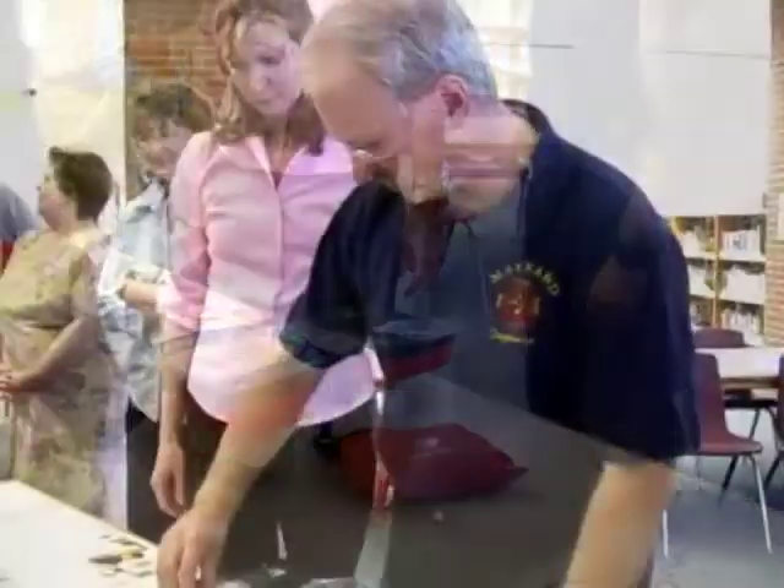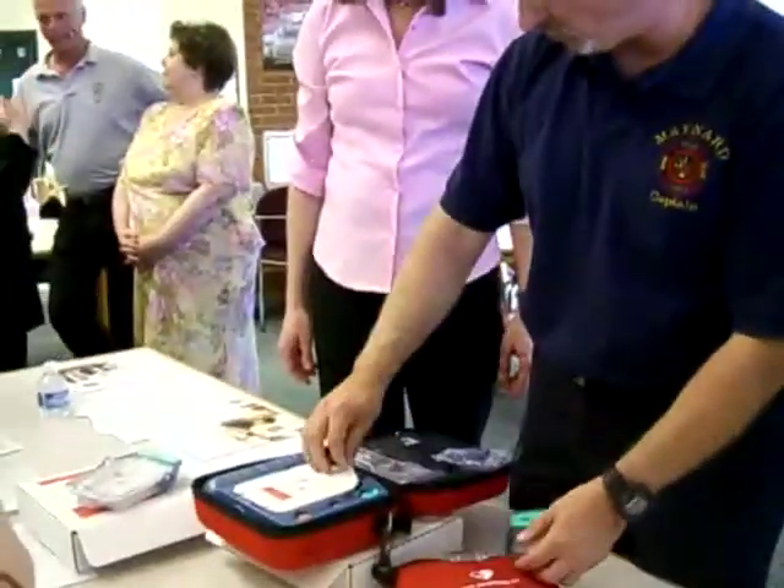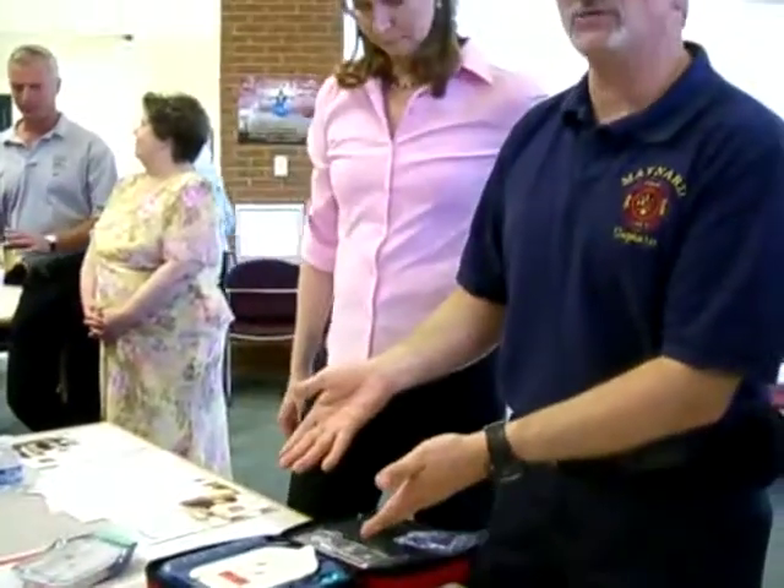Scenario two. What do you have to do? Take the cover off. Again, it talks you right through it.